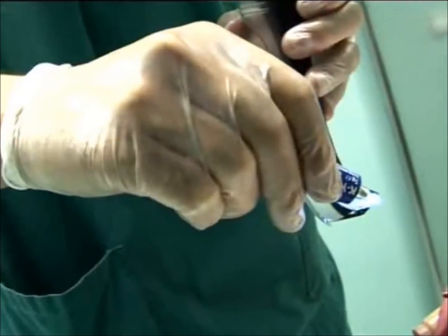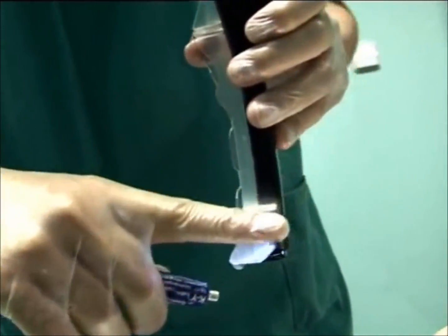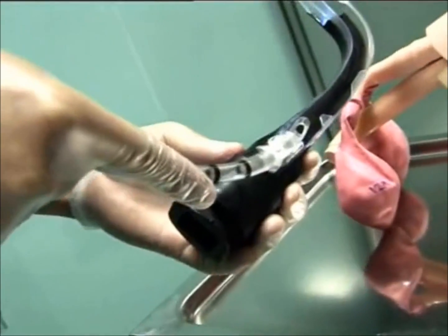Lubricate the ET tube and air-track blade. Keep the lenses clean. Insert the tube until the tip is even with the distal end of the guiding channel.